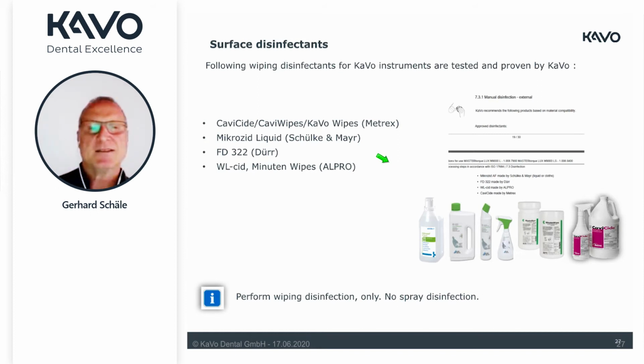An important point: always perform the wiping disinfection. No spray disinfection. The reason why is pretty easy to explain.